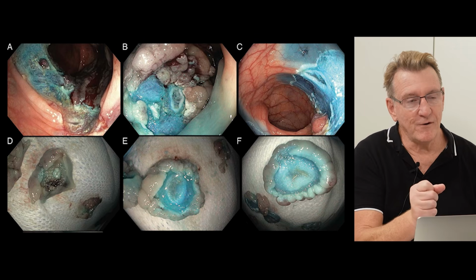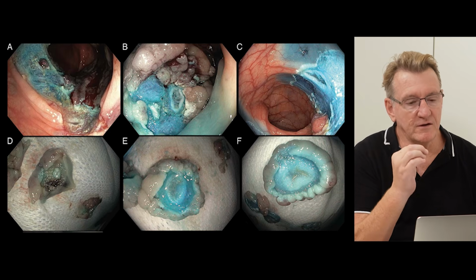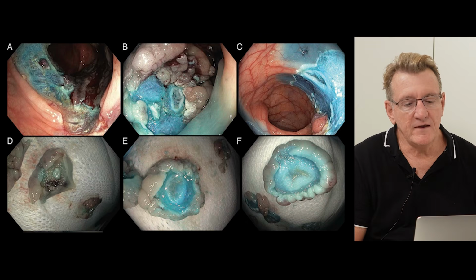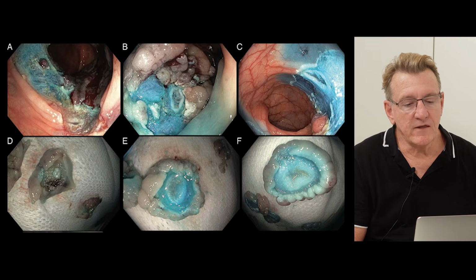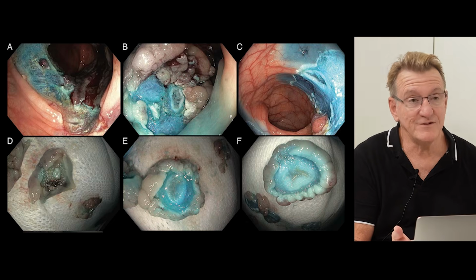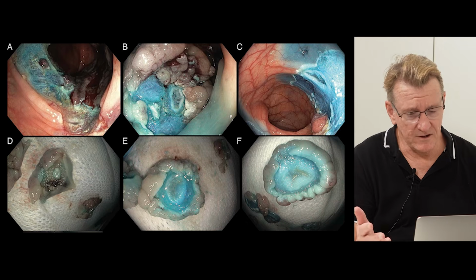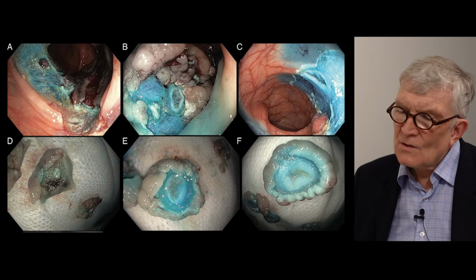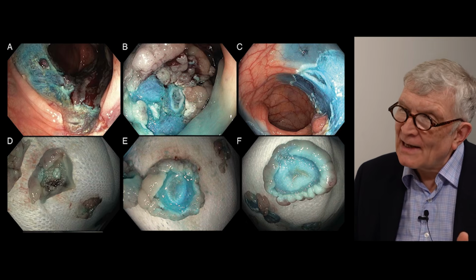The reason you don't see a hole is because everything is cinched together when you apply the snare, close, diathermy. This is the white cautery ring of mucosal excision. And if you see another white cautery ring inside of that, that is the white cautery ring of muscle incision. You've excised the muscle. That means the patient could go to recovery, they might even go home, but they will get a delayed perforation. If you sit there watching for hours, eventually it might open up, or it has a high likelihood.